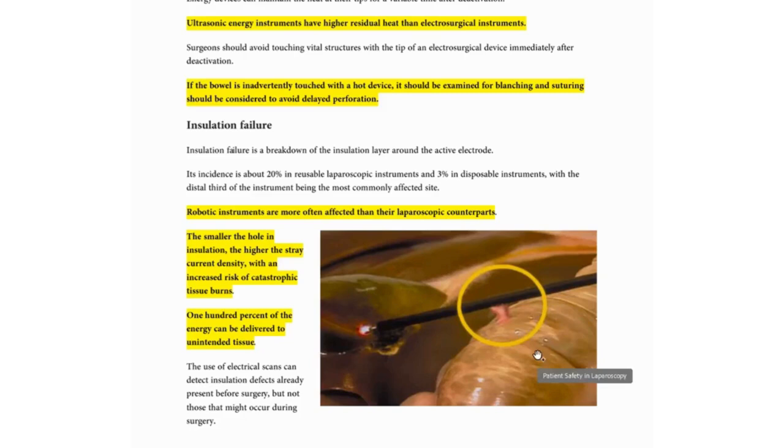Big difference. I will tell you why. Insulation failure, mainly, you can see it, or you can detect it, because it's going to be underneath the area you are working in. Capacitive coupling is outside the reach of your eyes, or you can say outside your scope, your working area. I will show you how.